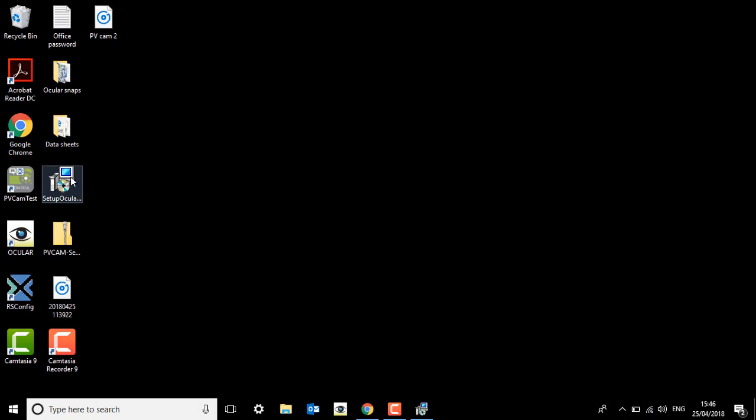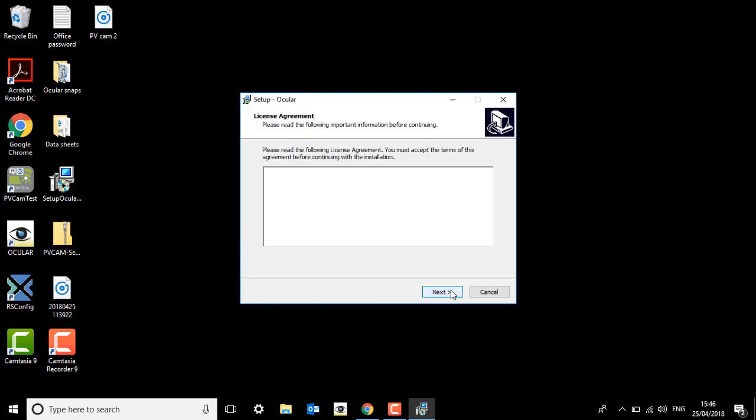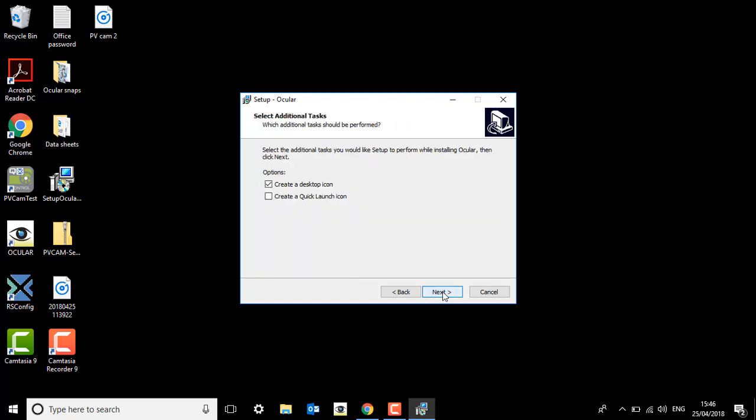If you open that you'll see this, and from here it's very straightforward. Just click next, accept the agreement. Of course, feel free to read that if you want. Next again, there's also an option to create a desktop icon.